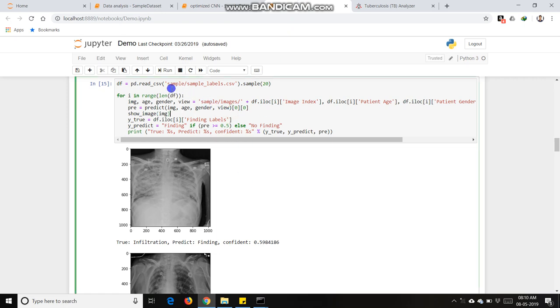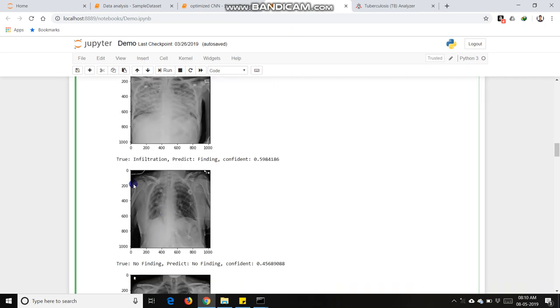This is our prediction. We can see that actually the X-ray image is infiltration infected and we predict that it is infiltration, so it makes correct predictions.